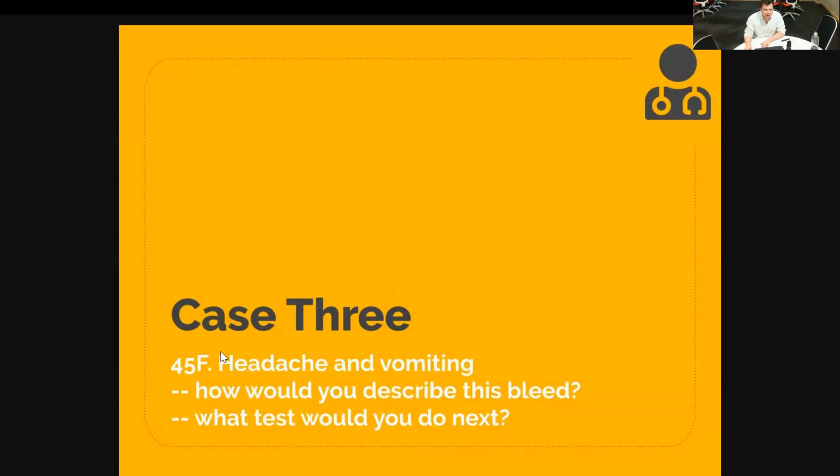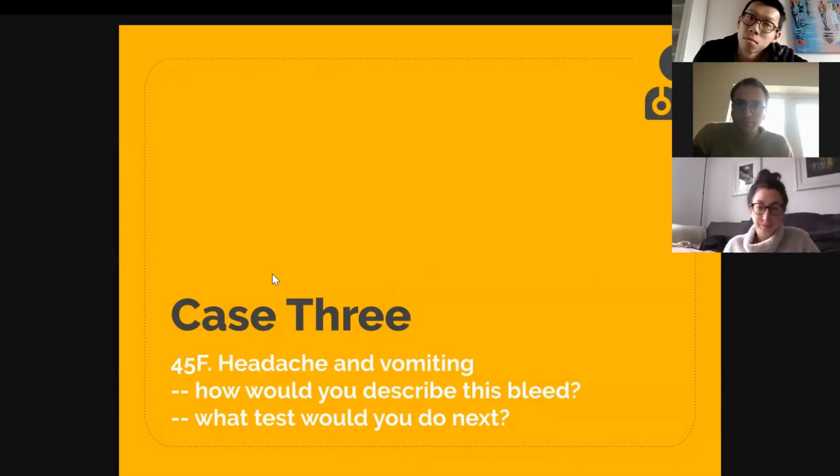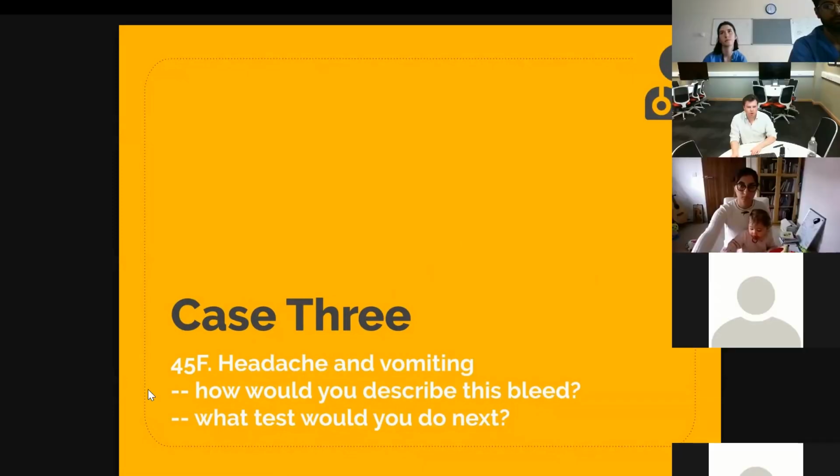So third case, we've got a young woman, headache and vomiting. So the questions were how to describe this bleed and what test would we do next. Pauline.